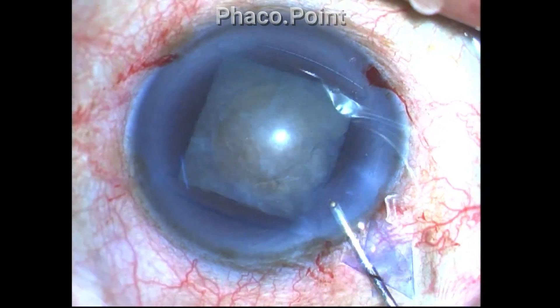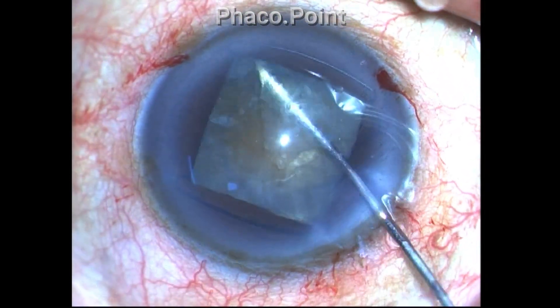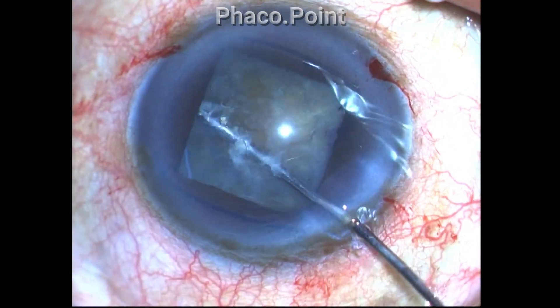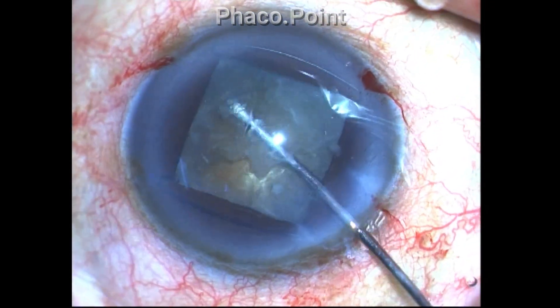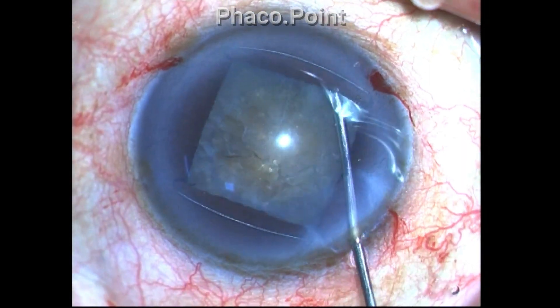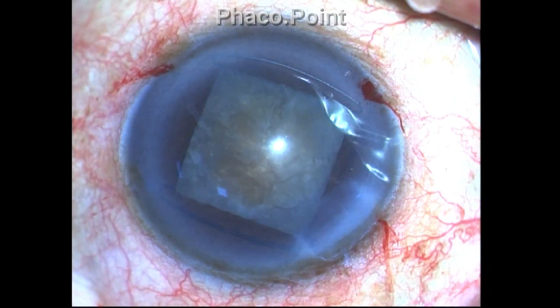Although cortical cleavage hydrodissection is not strictly necessary, there is a thin sliver of a hard epinucleus shell covering this nucleosclerotic cataract, and hence a gentle hydrodissection should be done at multiple points. The fluid wave of course cannot be seen, and therefore you have to rely on the rise of the nucleus.